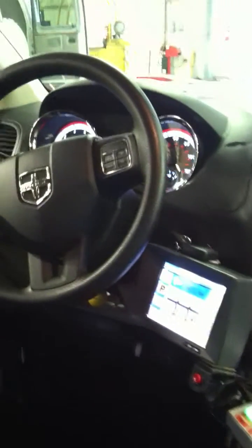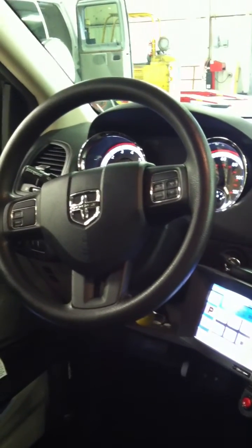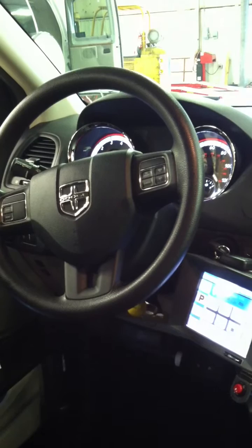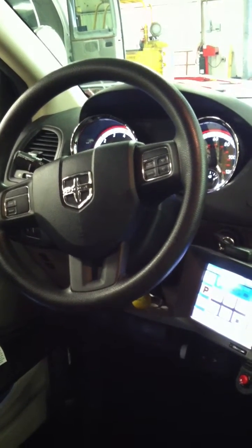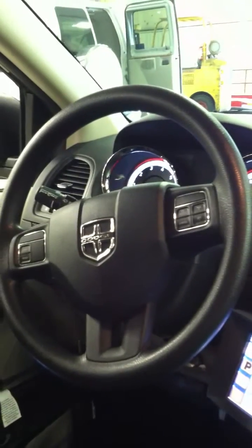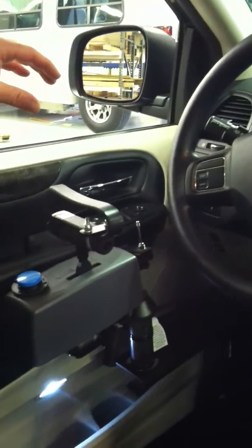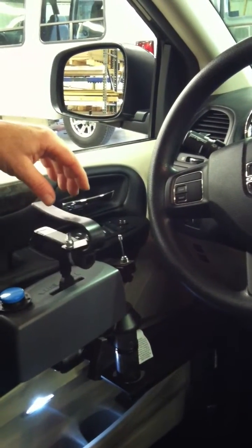Right now it's going to go through a testing phase to line the steering wheel up. It takes a couple minutes to do this. It's checking all the computers to make sure everything is good, then it tests the gas and the brake, and now it tests the steering. That's all good.